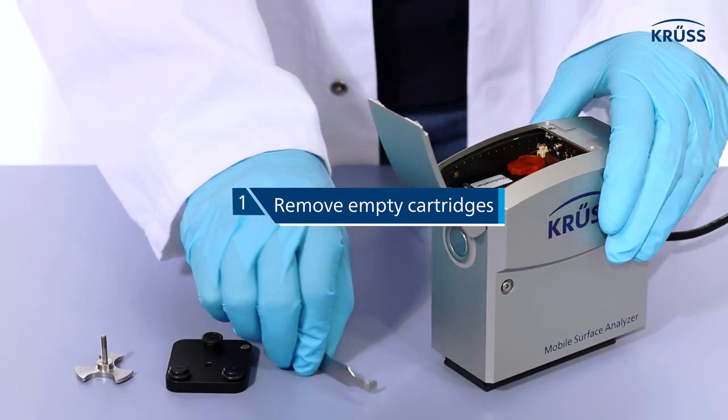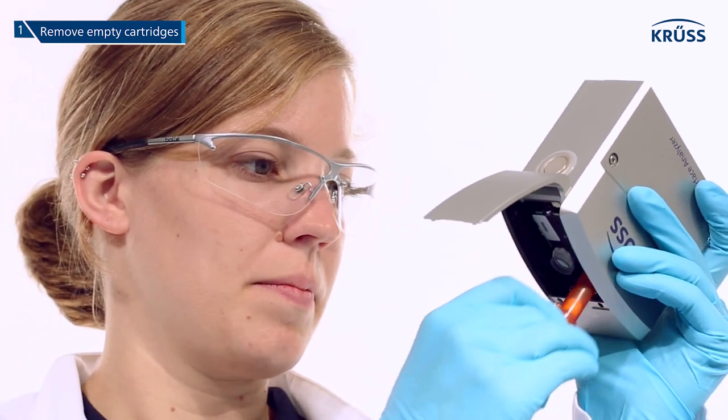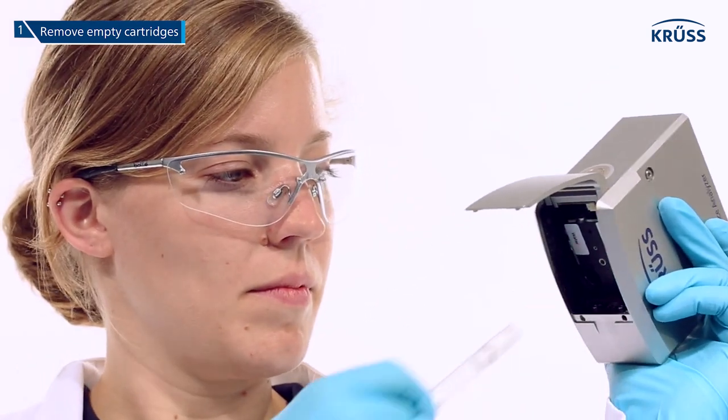Step 1. Take the empty cartridges out of the instrument with the tool provided, holding the MSA upside down to avoid liquids entering the electronics.